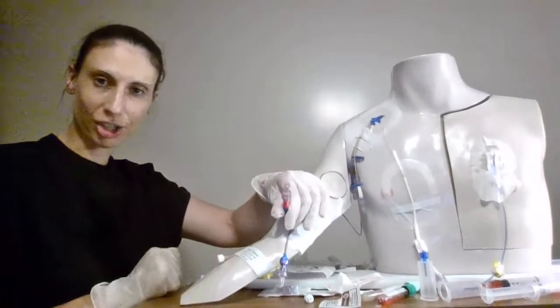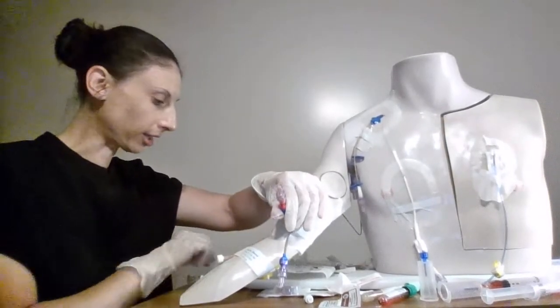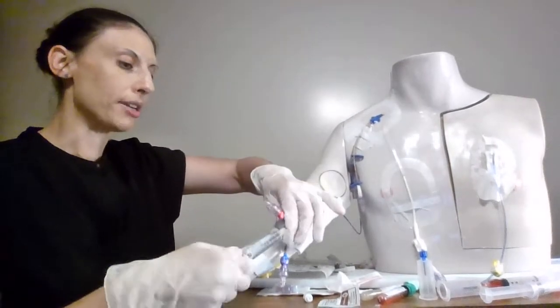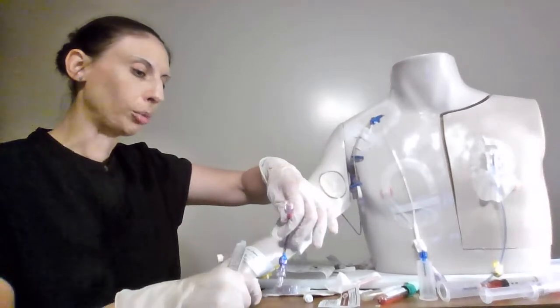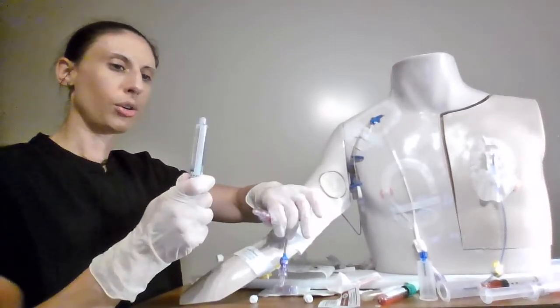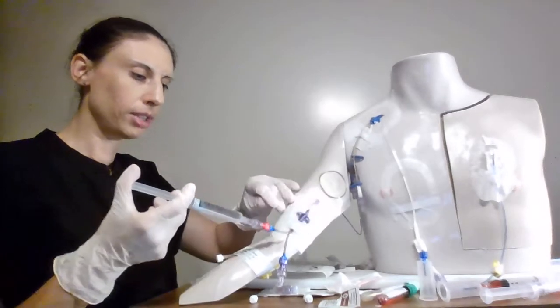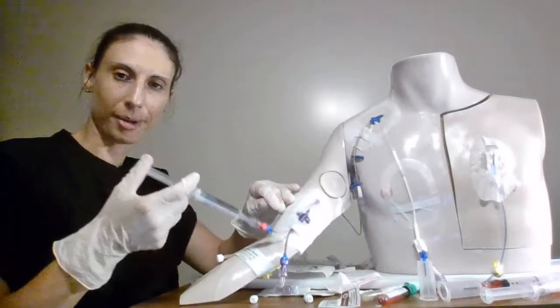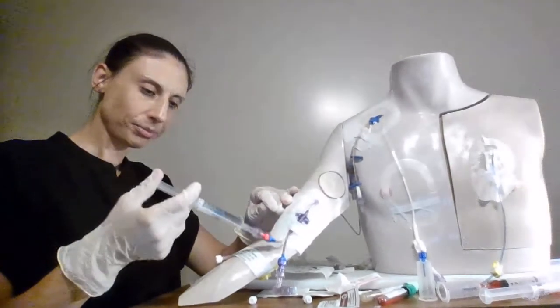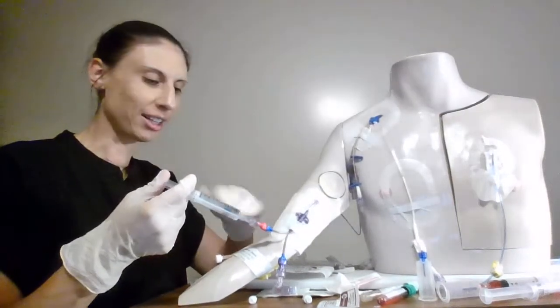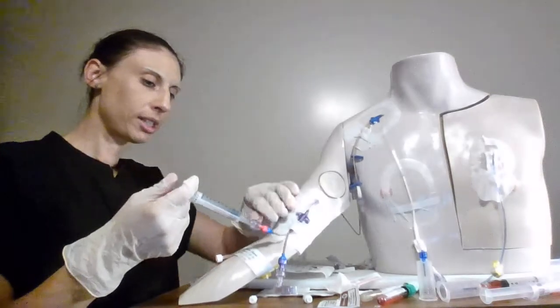Now my line I can't just leave it like this because it's got blood sitting in there. Remember blood is really sticky so we want to get rid of that blood. We don't want it to clot up our lumen. So we have our syringes normal saline filled. And we're going to use some pressure turbulent flow to try to clean that lumen. So one cc push pause.